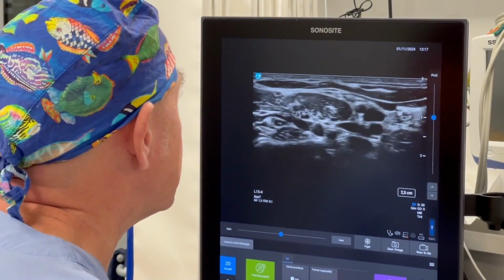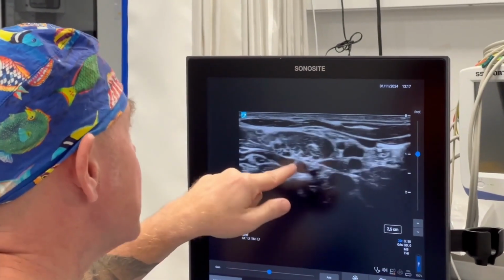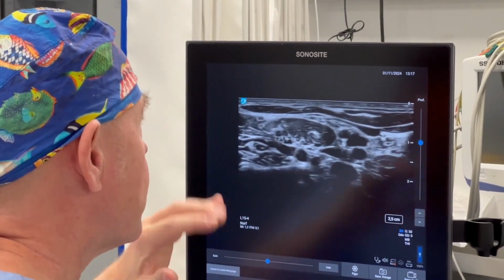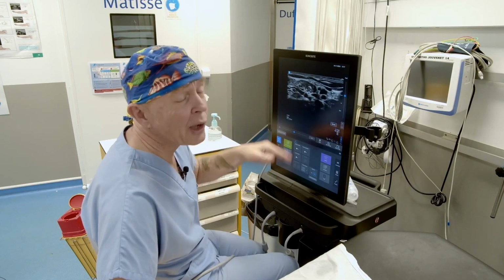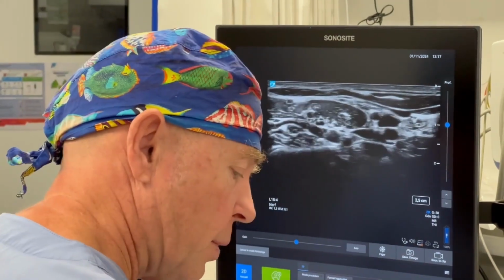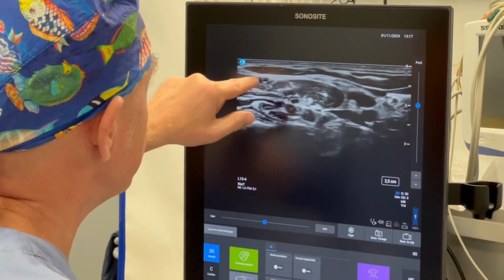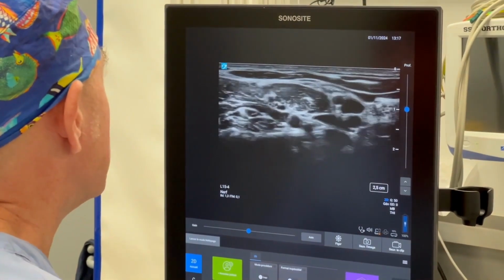So there are several reasons. First, we push the artery a little further away. Then we're sure to get both the anterior and posterior components of the inferior trunk. And that's often what's missing when you do the corner pocket, or when you use the classic supraclavicular approach, and then you have the superior trunk.